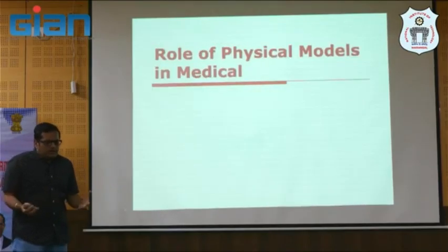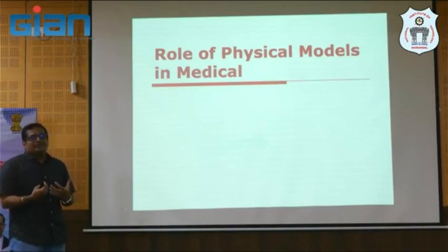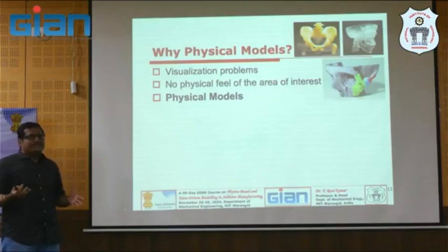Yeah, then you have a lot of virtual models. Then why do we need a physical model, which has been acquired from the patient data? Why do you want to print it? Your surgeon's confidence levels will be high.